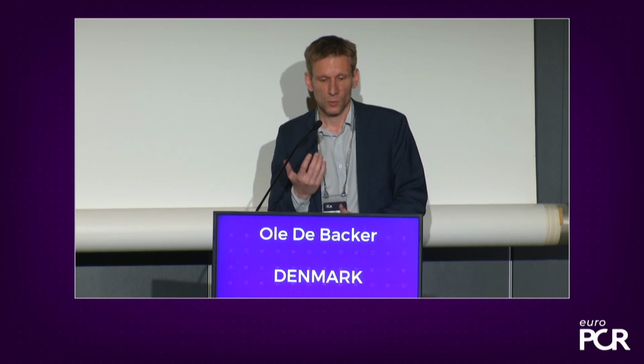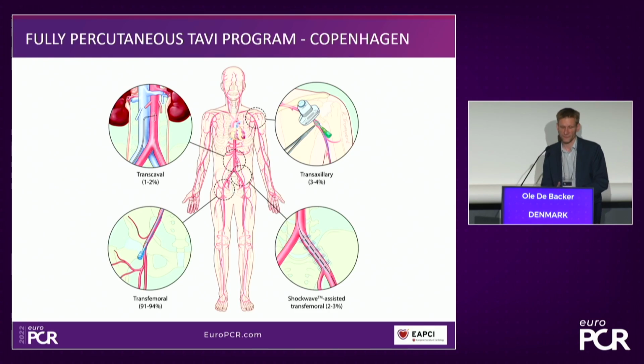So, what do we do already for 3 years? We do a fully percutaneous TAVI program, and I think that's where Shockwave is really great. It's really to, if you want to keep your TAVI program as minimalistic and fully percutaneous as possible, and I think really that's the way to go and where most centers are going.